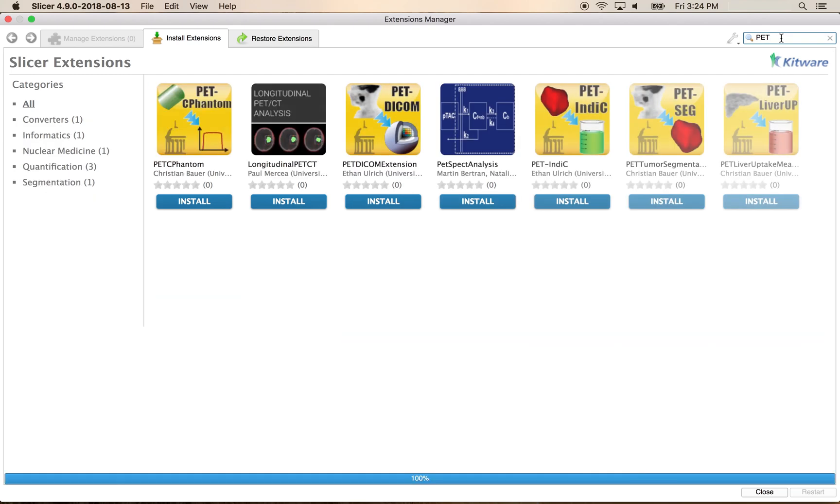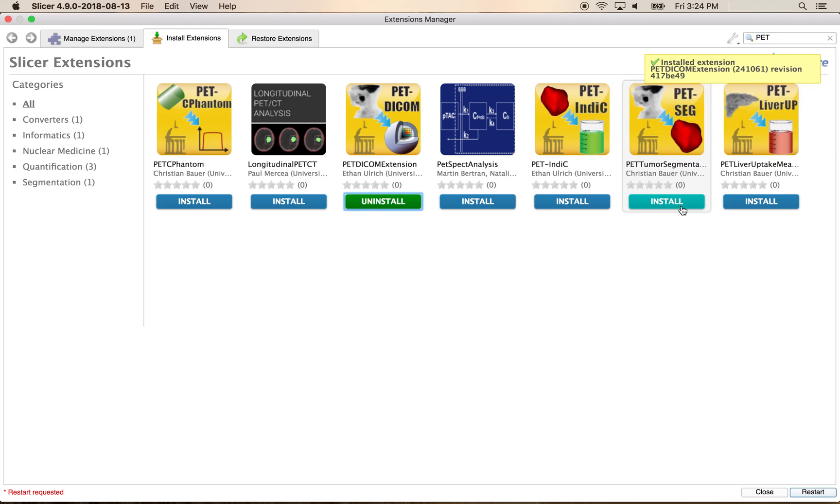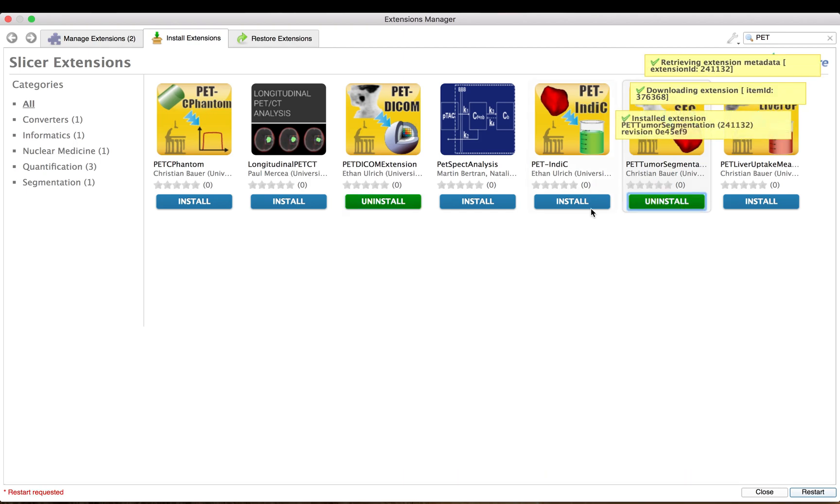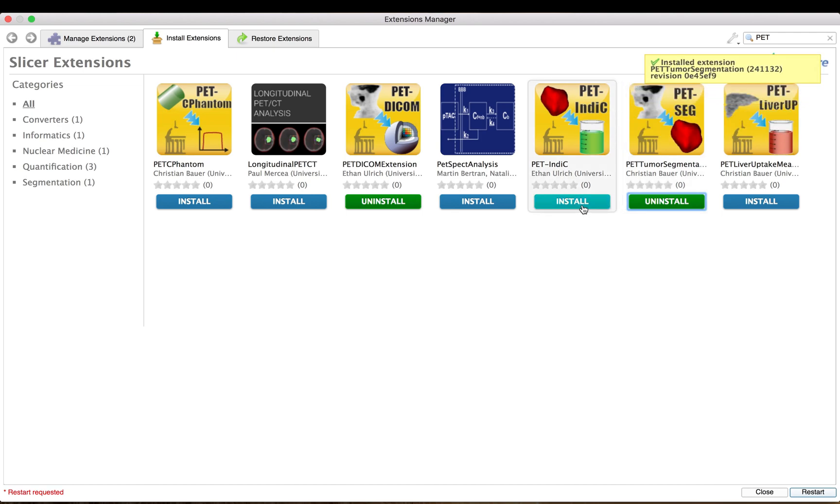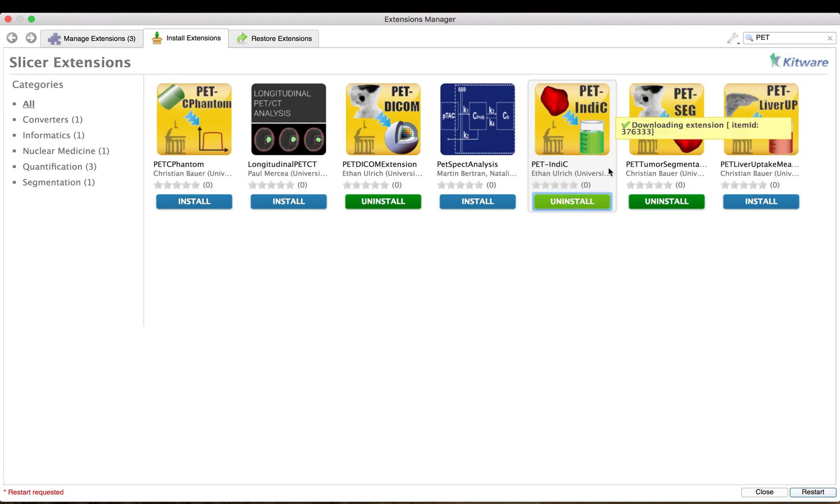We will install the PET-DICOM extension to enable the loading of PET scans with standardized uptake values, the PET-Tumor segmentation tool which allows segmenting lesions in PET scans with minimal user interaction, and the PET-Indicy extension for deriving quantitative indices specific to PET analysis.